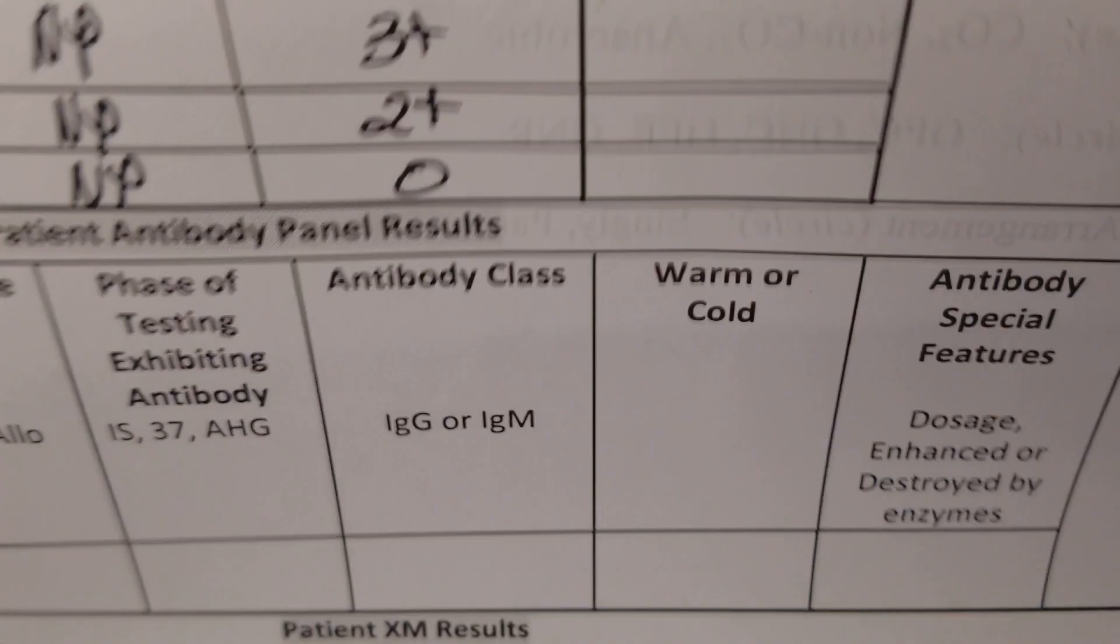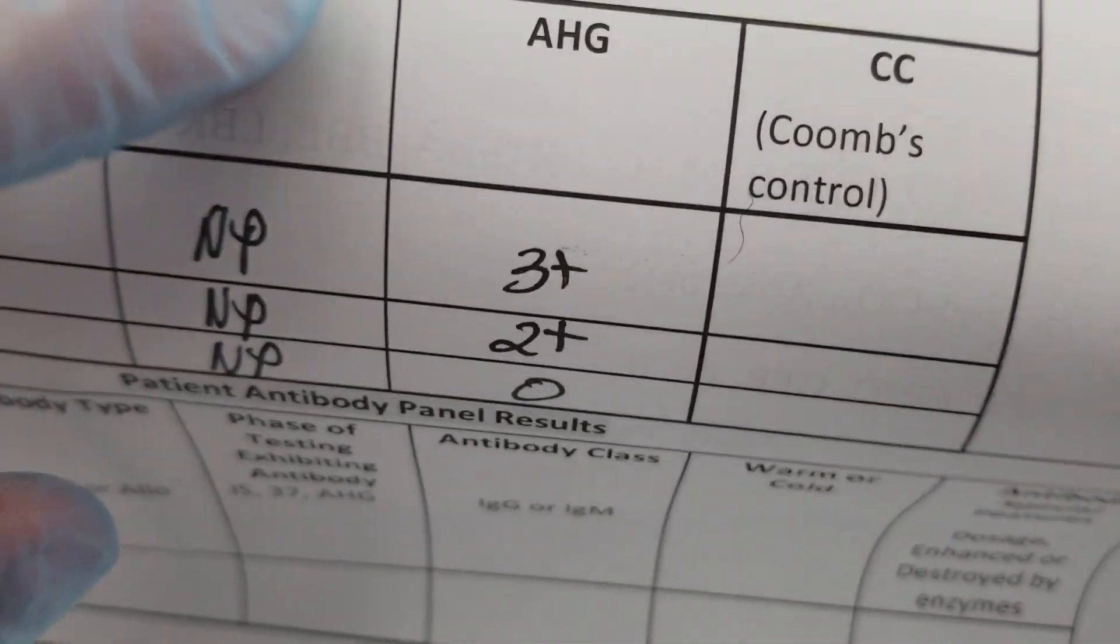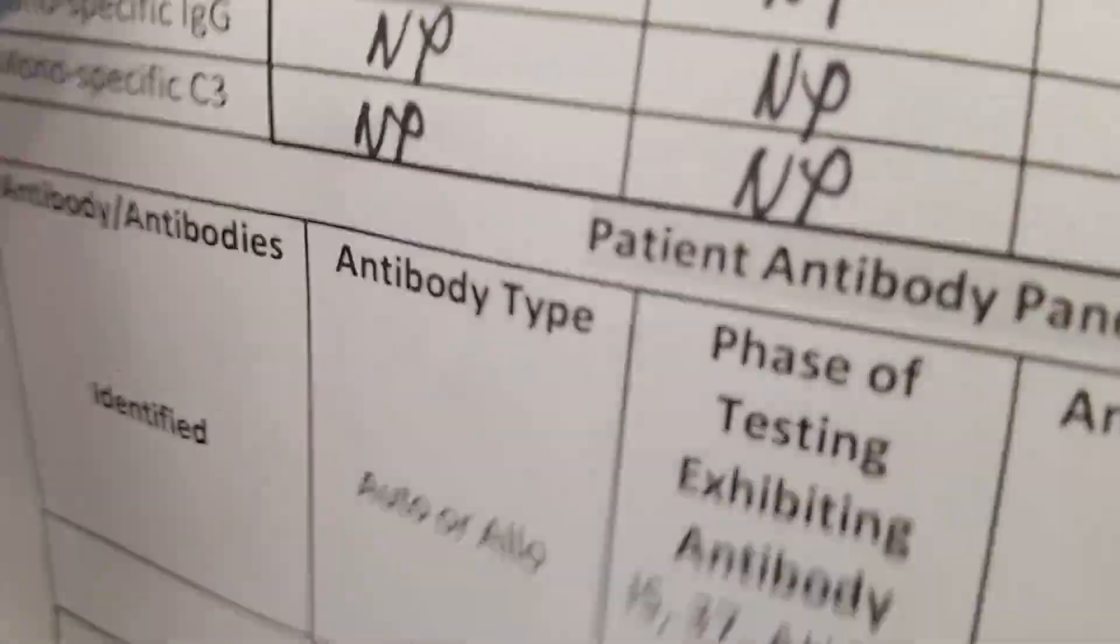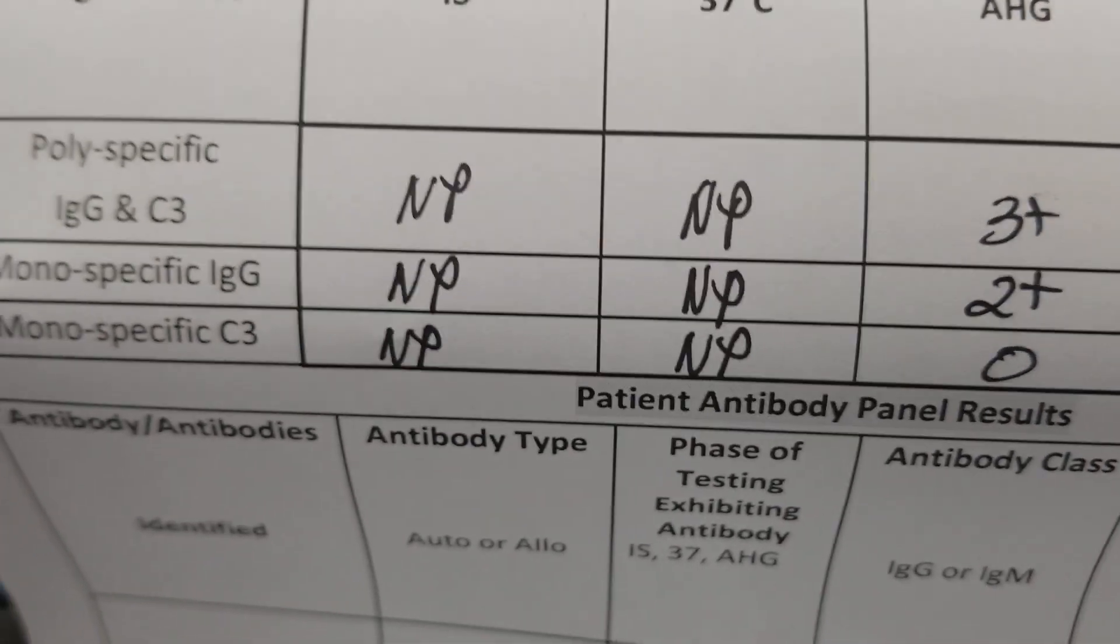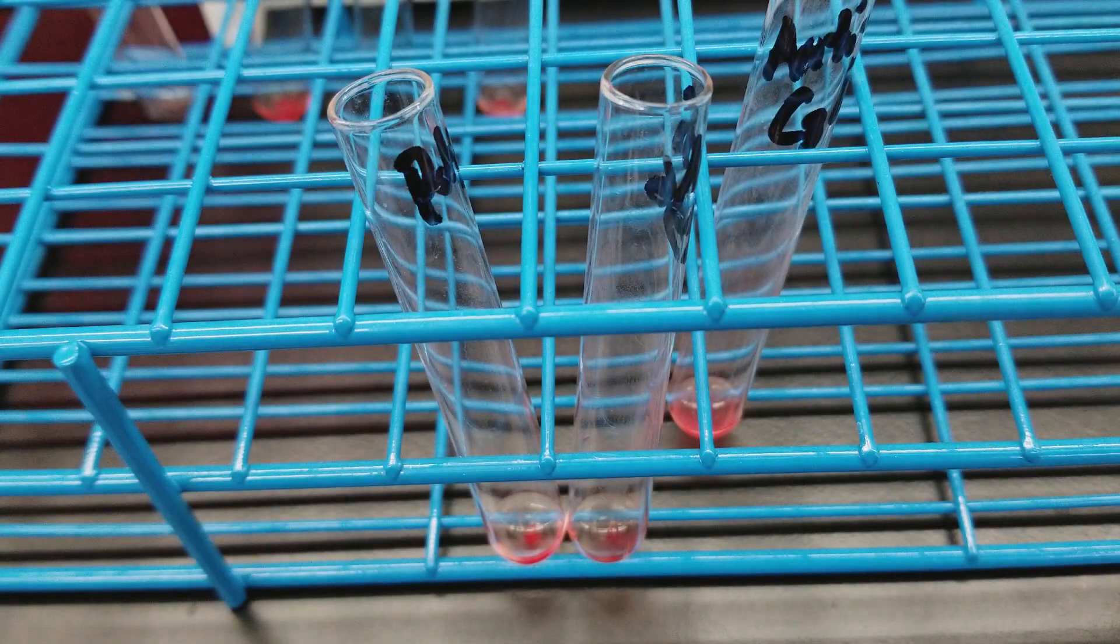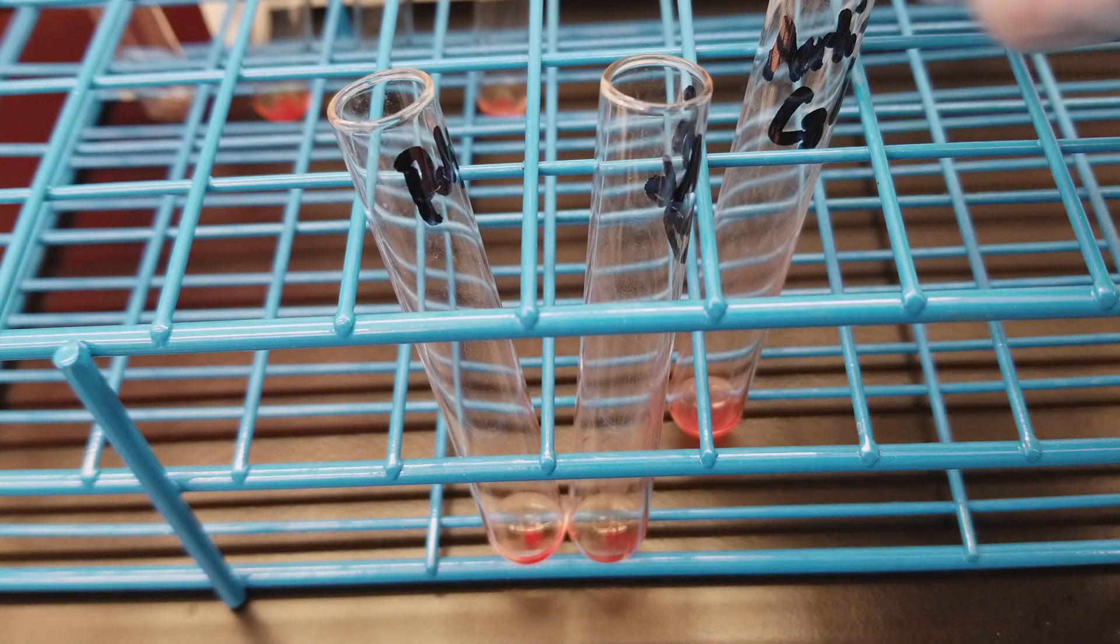So here are our results. We have the DAT results of three plus, two plus. So I'm going to remove these columns actually. But we have the polyspecific with three plus, the mono IgG was two plus. And then we're going to add check cells to the negative one, which is this.